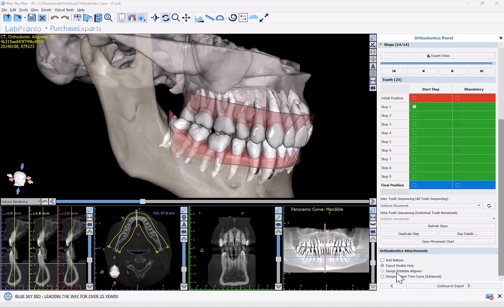We have the options to design printable aligners — Blue Sky Plan has FDA approval to do so — and we have the ability to design the aligner trim curve to use a mill in order to trim the aligners. We're not going to get into that functionality now; we do have relevant videos describing it. At this point, I'm going to select 'Export Models Only' and click 'Continue to Export.'